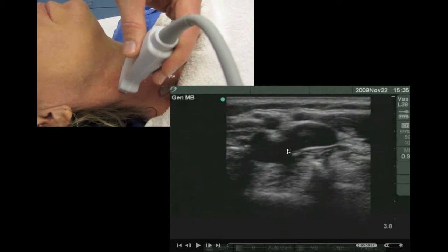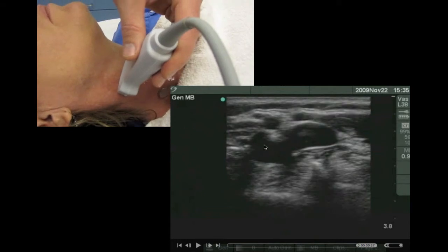And so what I like about the mid-neck location is that you see that the carotid here is adjacent rather than deep to the IJ. And so when I went down to the base of the neck, there was a bigger target, but it's closer to the lung. So it's maybe a little less ideal to go sticking down closer to a target that might be adjacent to something I don't want to hit.